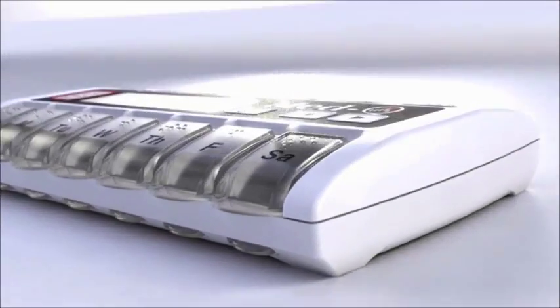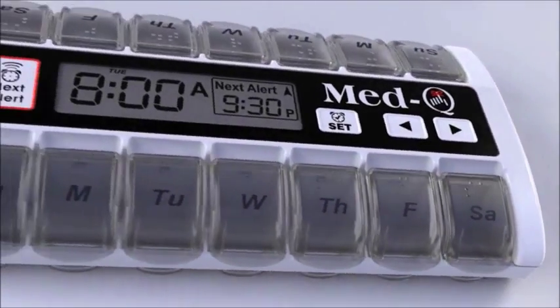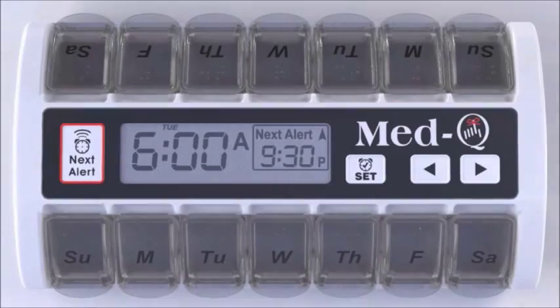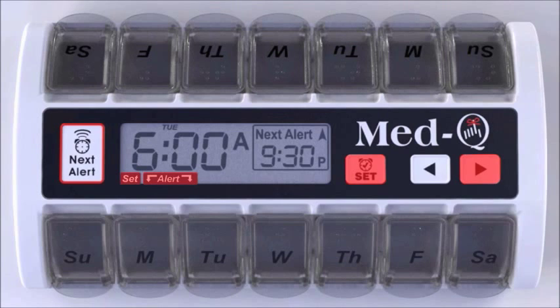Setting your alarm for two times a day for one week is simple. Watch how easy it is! Press the Set button and hold the arrow key down at the same time. Release. The hour will flash.